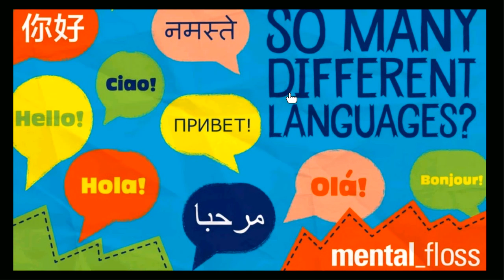So basically, it's like a language. CBCT interpretation is a language of 3D, one of the languages you have to know, and that's where the images will help you for implant placement, surgical guides, or pathology detection for endodontic purposes. Whatever you want to do, it'll help you. So you have to know this language well, and the basics of this language start from this lecture. It was a long-term request from the school to get this new course going, and I took the lead in running this course.